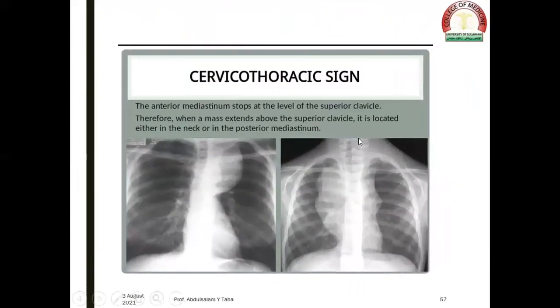In this example, we have a large opacity in the upper chest. The upper limit of the opacity is below the level of the clavicle. Therefore the lesion is located anteriorly — and that is the value of the cervicothoracic sign.